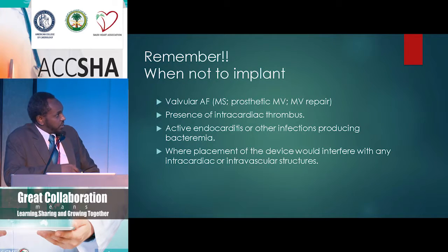Remember also not to implant devices in patients with valvular AFib, of course, in the presence of intracardiac thrombus and active endocarditis or other infections producing bacteremia, and where placement of the device would interfere with any other intracardiac structures.